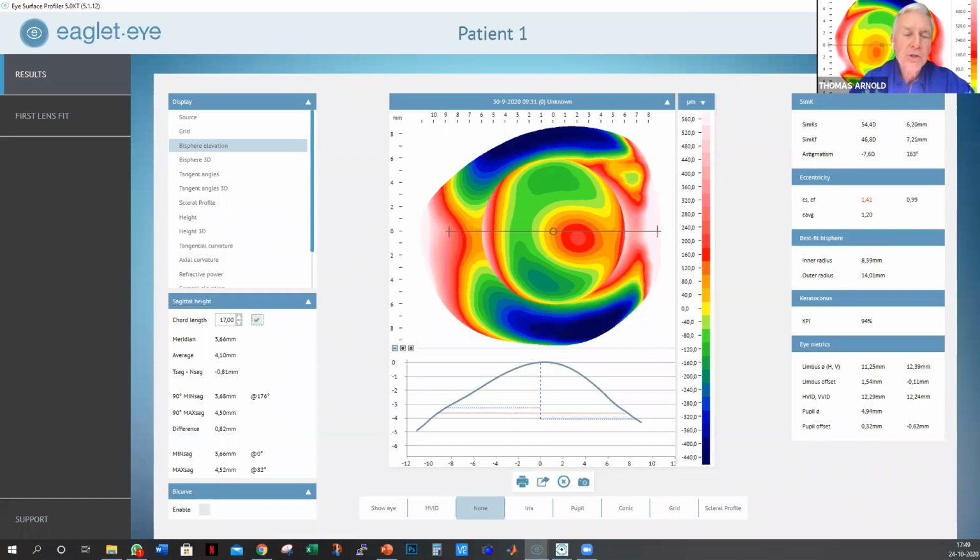Well, studies on scleral shape that have been published really in the last 3 or 4 years have just demonstrated how toric and asymmetrical the scleral shape is in patients. One paper from a couple of years ago estimated that of 140 patients, 66% had no regular periodicity in the scleral shape. That means they weren't with the rule or against the rule toricity of the sclera. So, people are a lot more ectatic than you think.